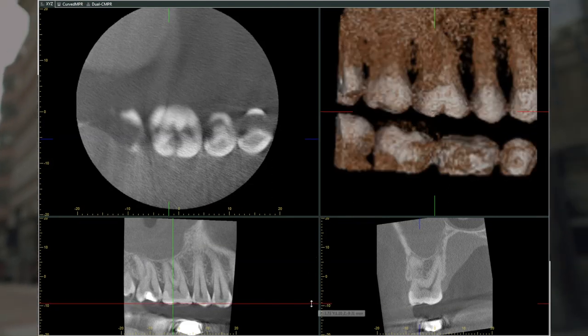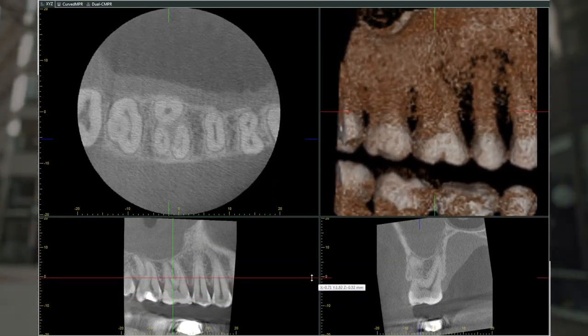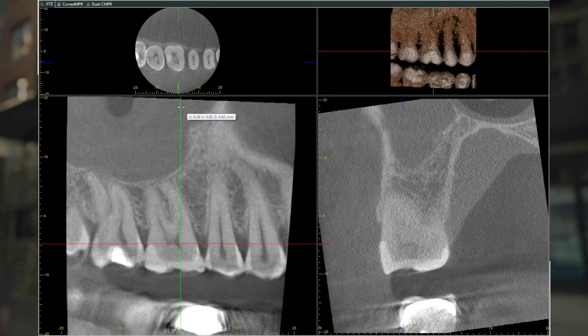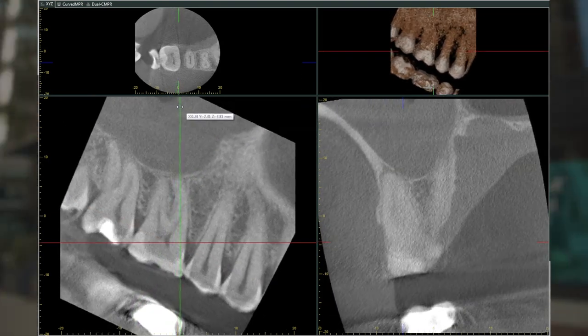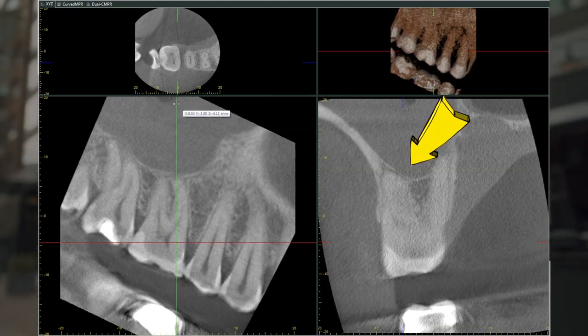A CBCT was also taken, as usual, to determine the anatomy. It showed about three canals, although the mesial buccal was a little oval, which makes sense. The apex on this tooth, based on the CBCT, was showing a little abnormality, so I was kind of expecting something to be there.